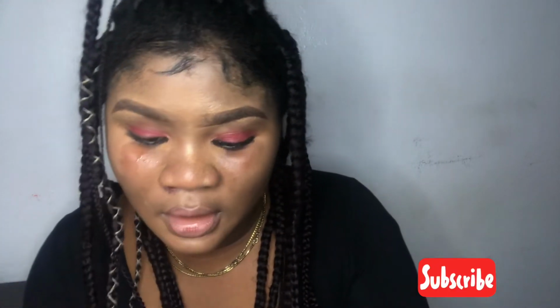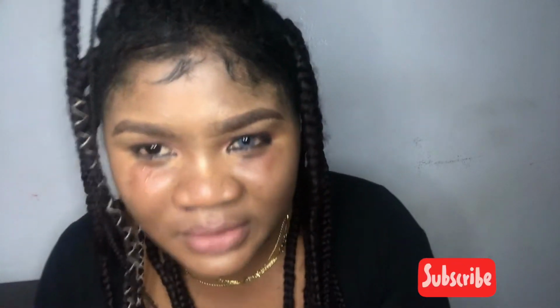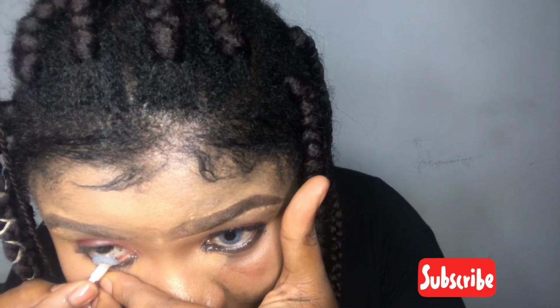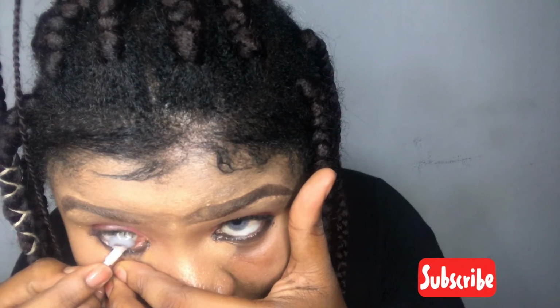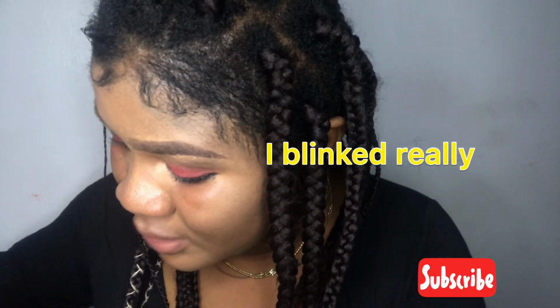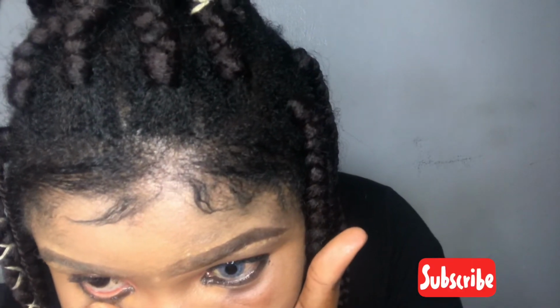I see people say they get used to it, even after like 10 times of fixing it. It's not, and my eyes are really small. Don't blink. Just put it inside once. You did not get it, oh, bring it out. But it has almost entered now. You blinked. No, you have to blink for it to go into place. Yeah, but it has not entered now. It must enter first before you blink.